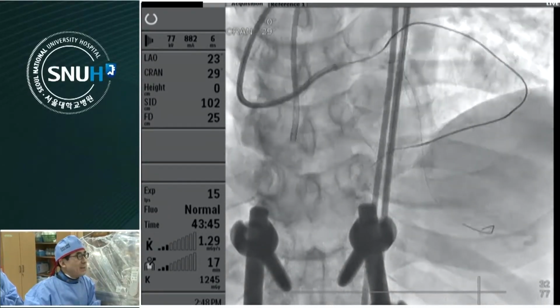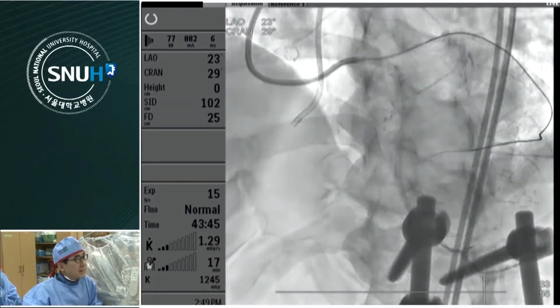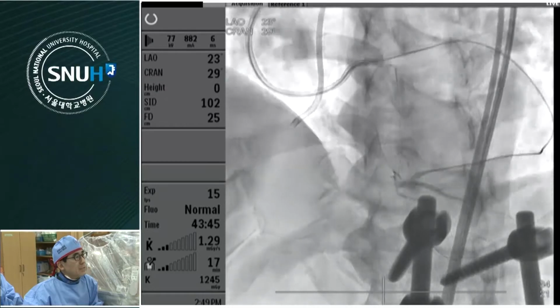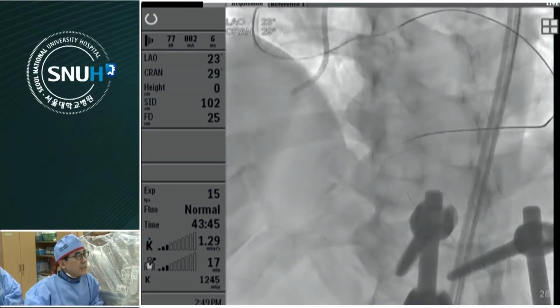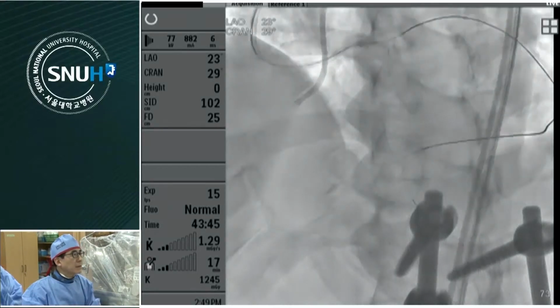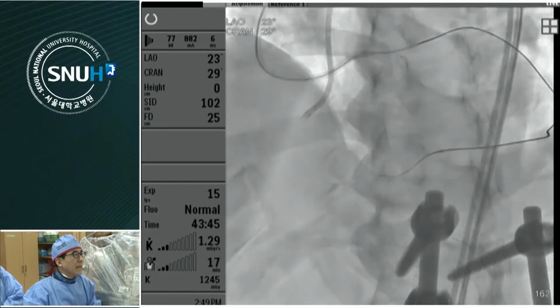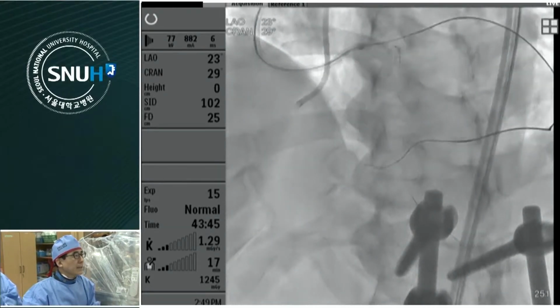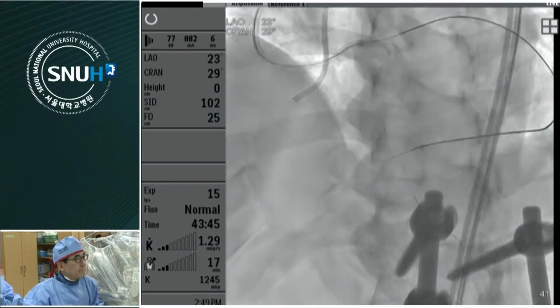But the distal cap is too hard. It's very difficult to puncture the distal cap. The third CTO segment is very hard. This is a tip injection. This is the Conquest Pro. It's very hard. Thus, I just made a knuckle and pushed it until this point, and then I switched to the antegrade approach from now on.